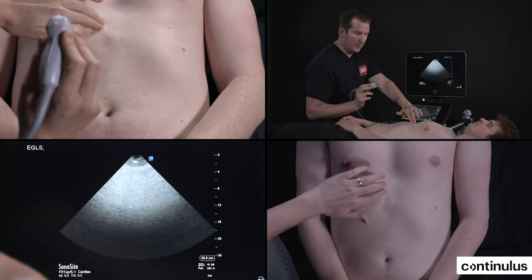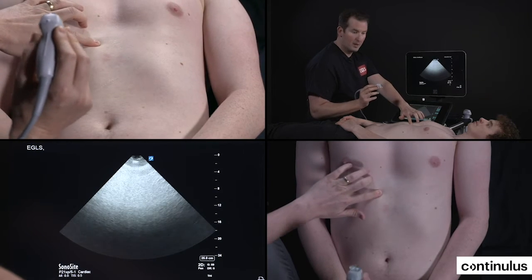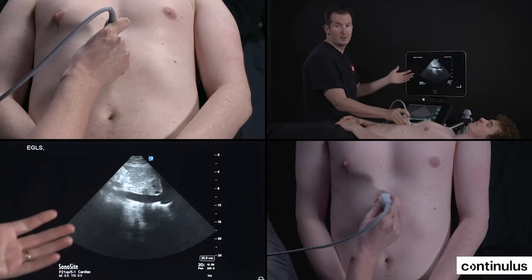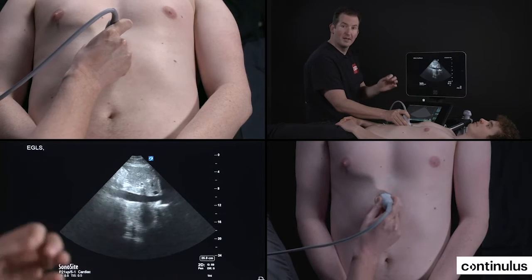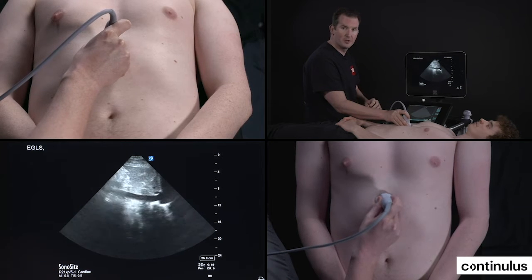As I palpate up and go to the xiphoid process, I go back just a millimeter or two, and that's usually the area where we'll find the IVC. So now I was lucky, I was already on it, but if you palpate the rib cage and do this, you'll often be at the right spot from the start.